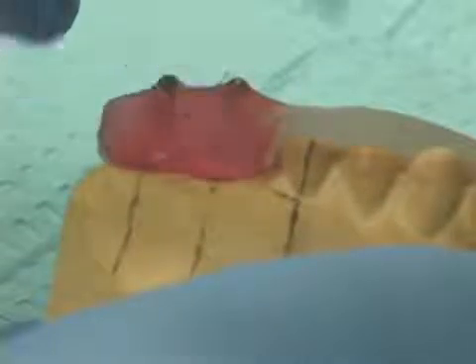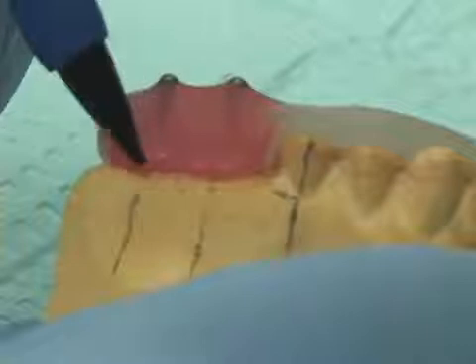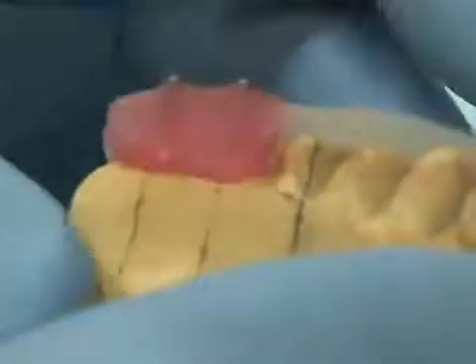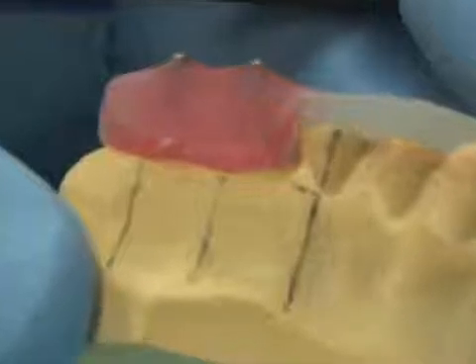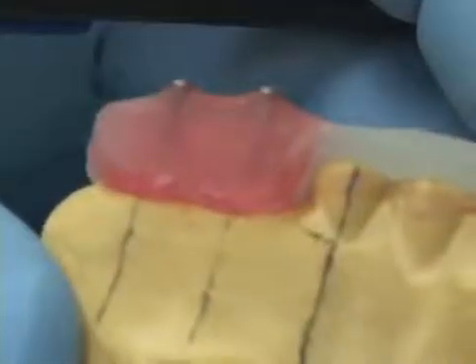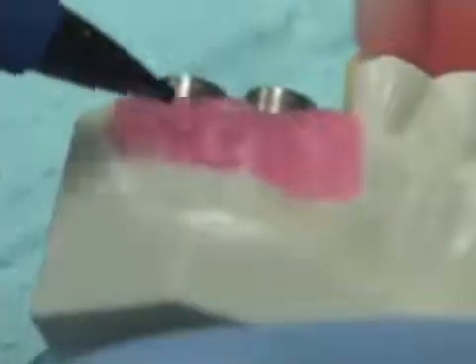And so by making that contour on our radiographic guide, at the time the surgery is done, the surgeon can place that guide on the patient once they have laid the flap in this area. And then when they go ahead and contour the crest of the ridge prior to placing the implants, they contour the crest of the bone, the ridge crest, using the ridge crest preparation guide.